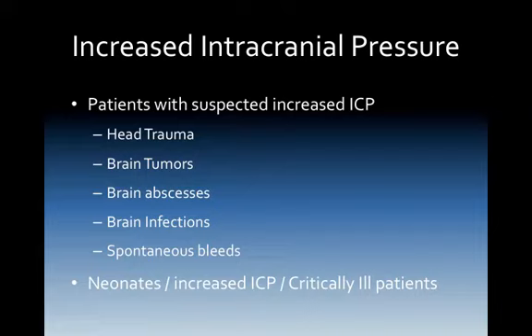So if they're posturing and you have a rapid increase in intracranial pressure, very simply, you could hyperventilate them a little bit and see if it subsided that increased ICP. Don't get extreme with this. Don't take them to extreme ends. So monitor. You want to just adjust it very, very little. So towards the lower end, maybe at 35, maybe at 32, 34. Start off with that, see how your patient does and interacts clinically.